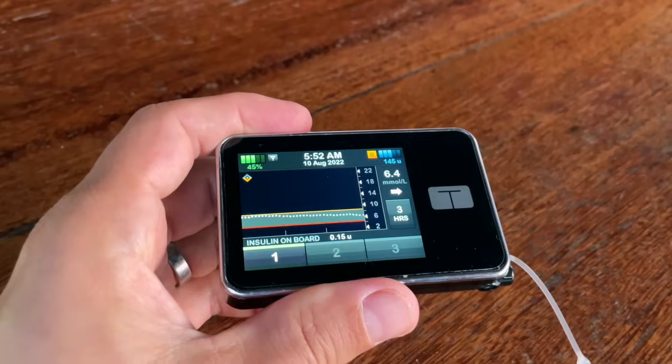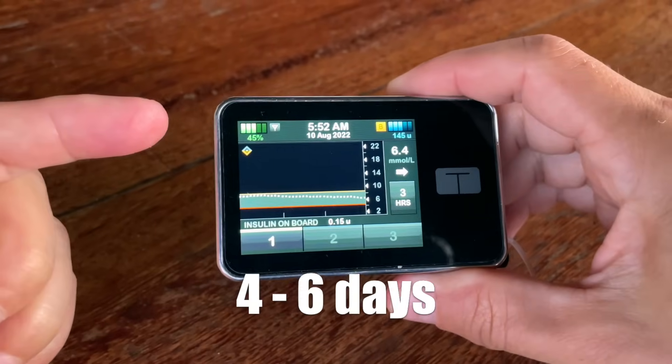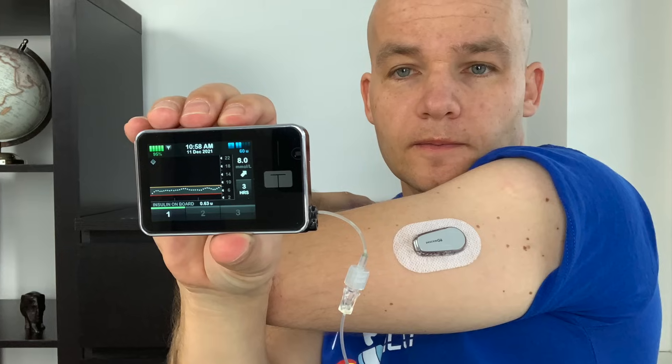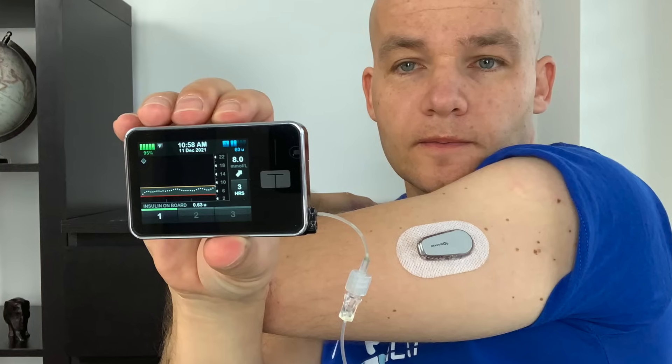The battery also lasts very long. From my experience I can go about four to six days, even on days when I'm also using Bluetooth to read data from my continuous glucose monitor. I'll talk about the CGM integration a little bit later in this video.